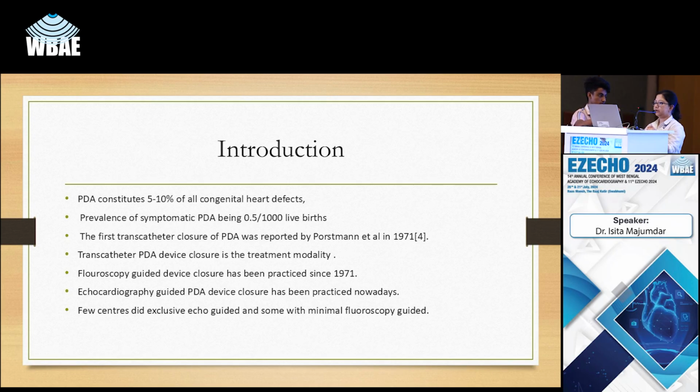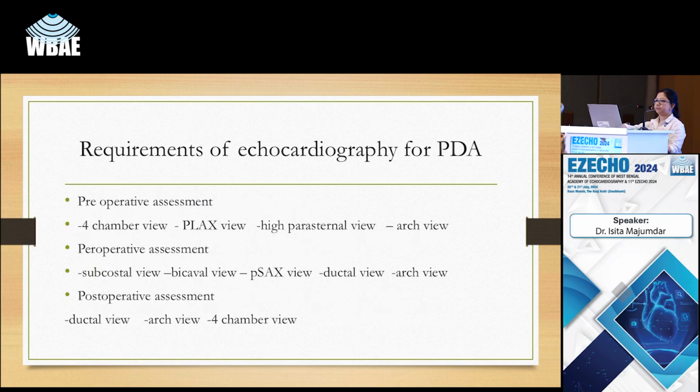Fluoroscopy guided device closure and echocardiography guided PDA device closure have been practiced nowadays. Few centers did exclusive echo guided closure and some with minimal fluoroscopy guidance. So, requirements of echocardiography for PDA closure.